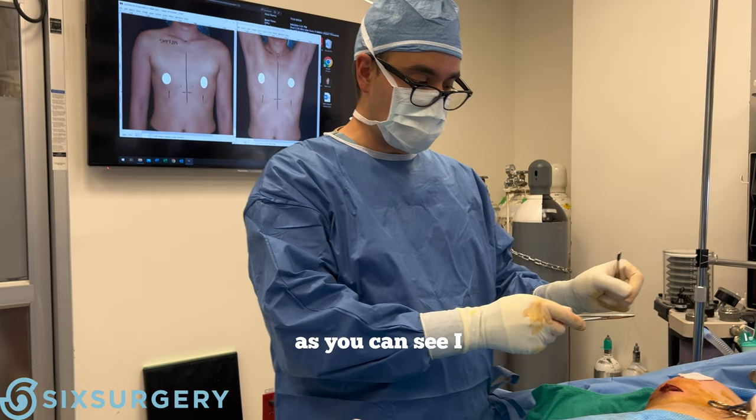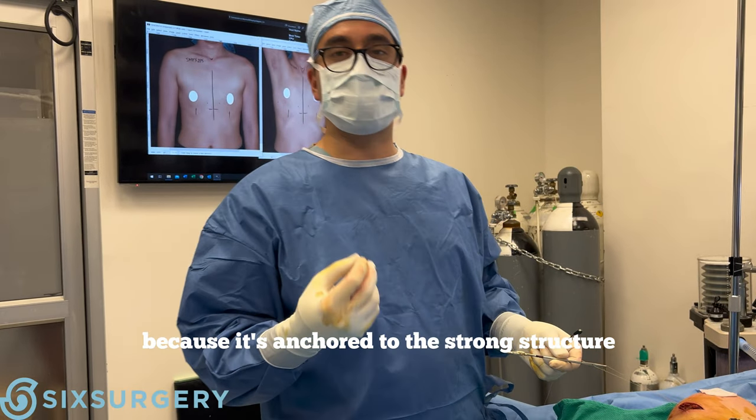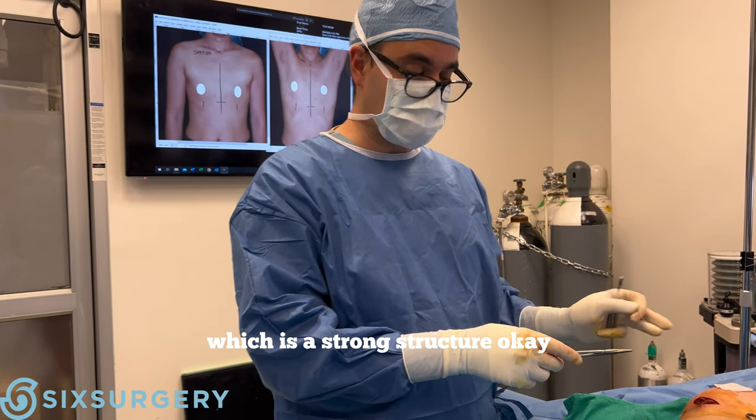I'm doing this for some reinforcement. As you can see, I can almost lift the patient off the table just with the suture, because it's anchored to the strong structure that is the IMF — the inframammary fold — which is a strong structure.